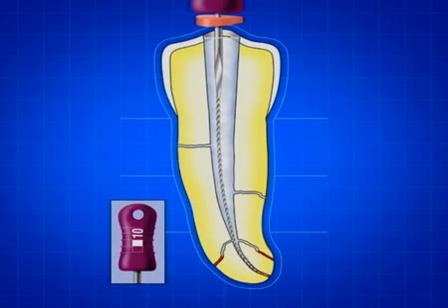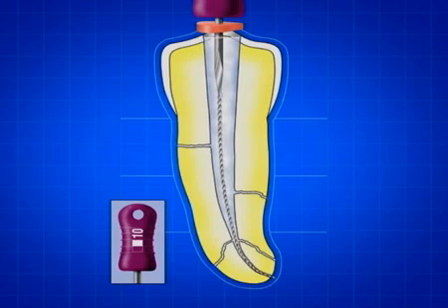If an obstruction is encountered, the pre-curved file is utilized in an apically directed picking action while continuously reorienting the unidirectional stop. The goal is to find a stick. An apically engaged file will demonstrate handle flutter. This information confirms the clinician is following versus making a canal. Using a viscous chelator, gently work the instrument to length and establish patency.